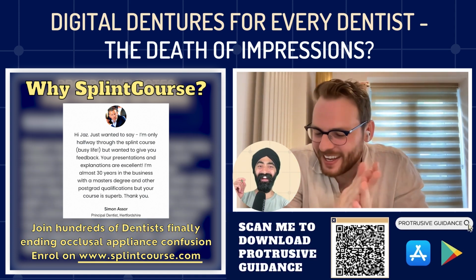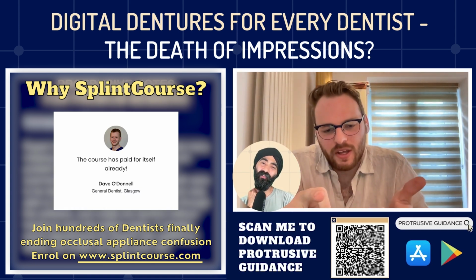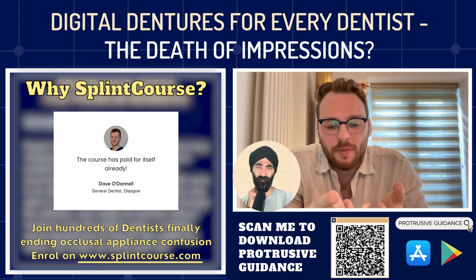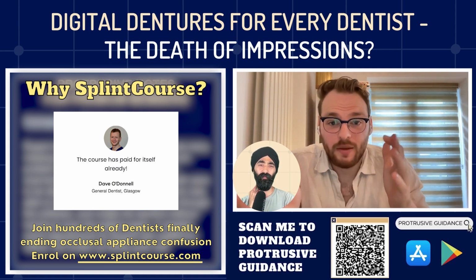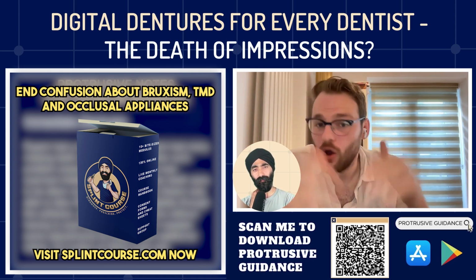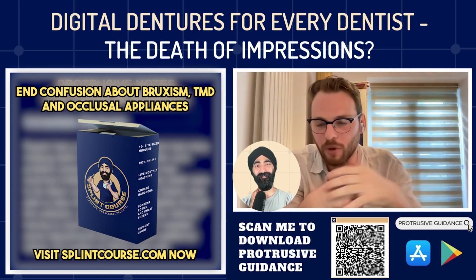Amazing, fantastic. Yeah. Well, it's called Staged Immediate Dentures on my page, and basically the chap had a load of missing teeth, perio, had never worn dentures, so I scanned him in the consultation anyway. We made a partial to replace the missing teeth that were already there, and a couple of teeth were extracted, to see how he tolerated it. Then Dean kept the model on record and said, right, take off all the upper teeth and make a complete off the same scan. Again, that's quite nice. It's just sat there on the cloud. You can just bring it back, print it off. You've not thrown away the model.